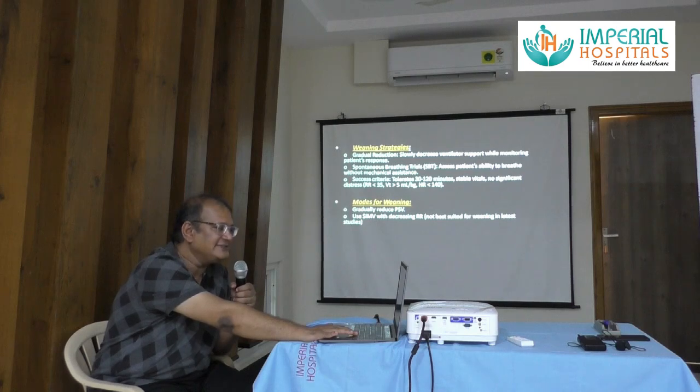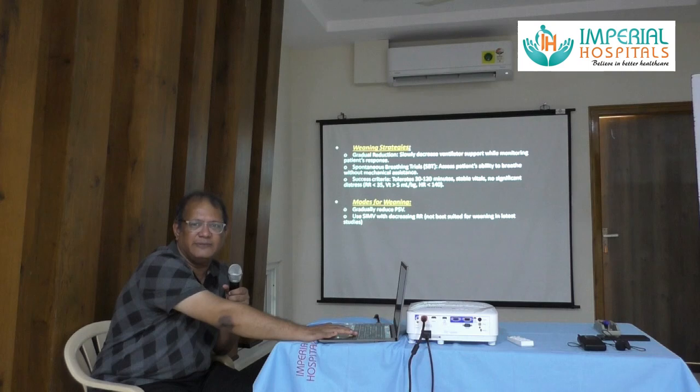Spontaneous breathing trials. Success of a spontaneous breathing trial is that he has to tolerate it for 30 to 120 minutes with stable vitals and no significant distress. Modes of weaning are gradually reducing from SIMV to PSV and decreasing the pressure support, right? SIMV as weaning has not shown any benefit if you use only SIMV as criteria for weaning.